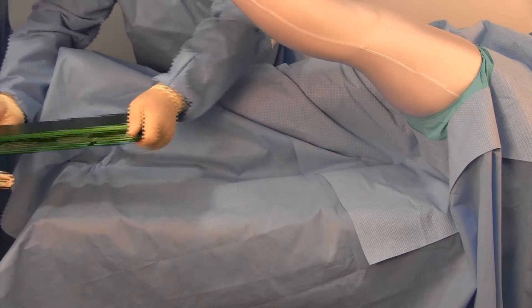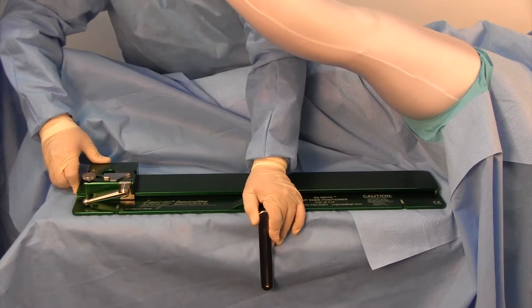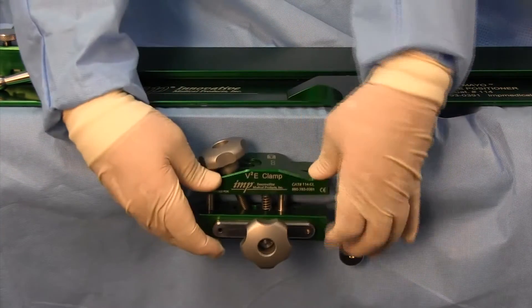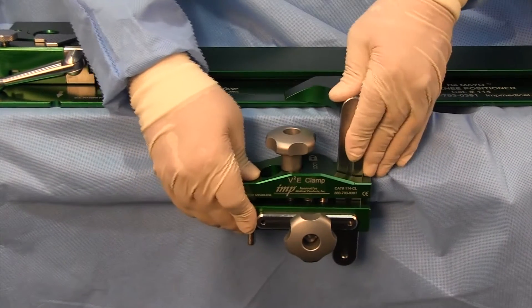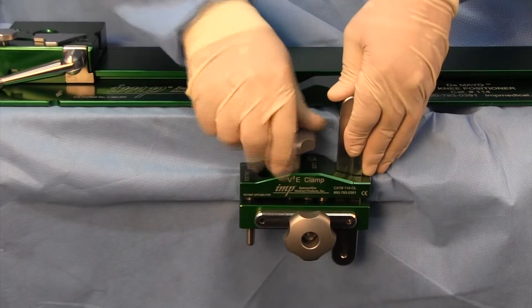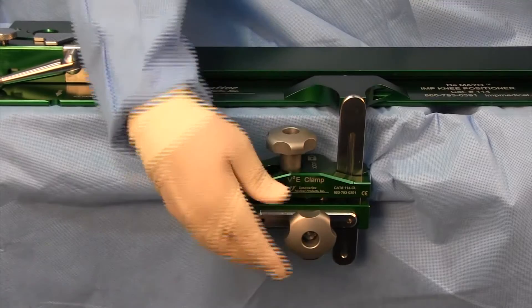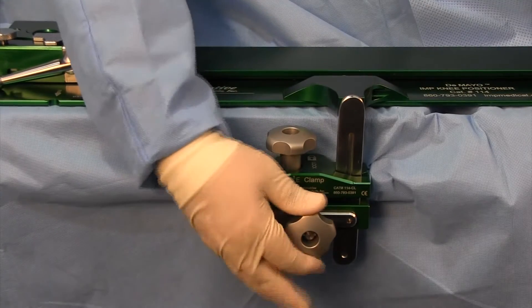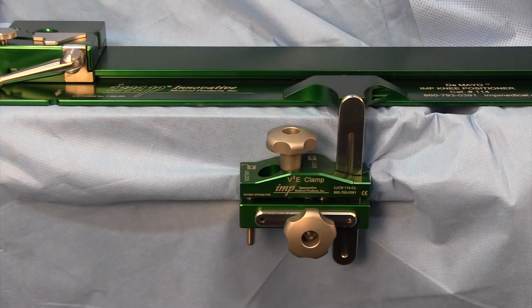Then put the base plate of the positioner down on the table. Approach the table with the jaws of the clamp fully open. Put the clamp onto the side rail and pinch the jaws together. The locking knob of the clamp will rotate into place. Swing the locking bar of the positioner into the clamp, then lock the top knob of the clamp, tighten the lower knob, and lock to the bar.